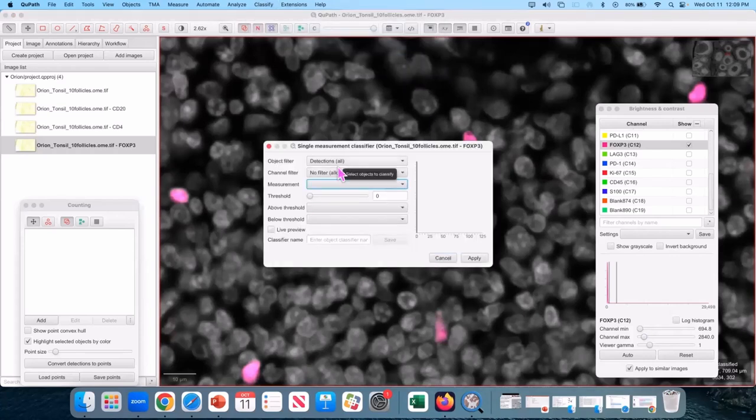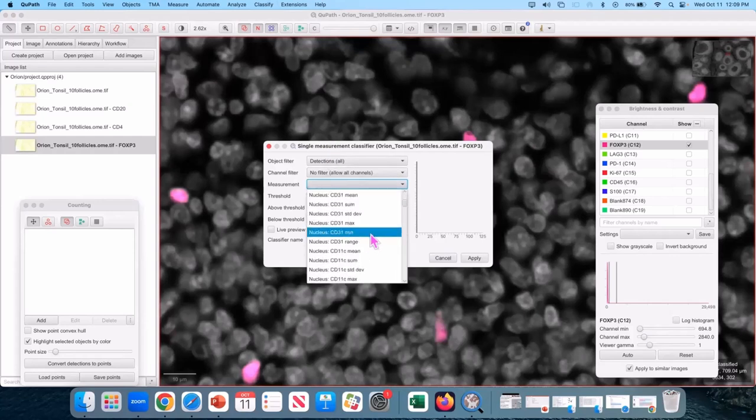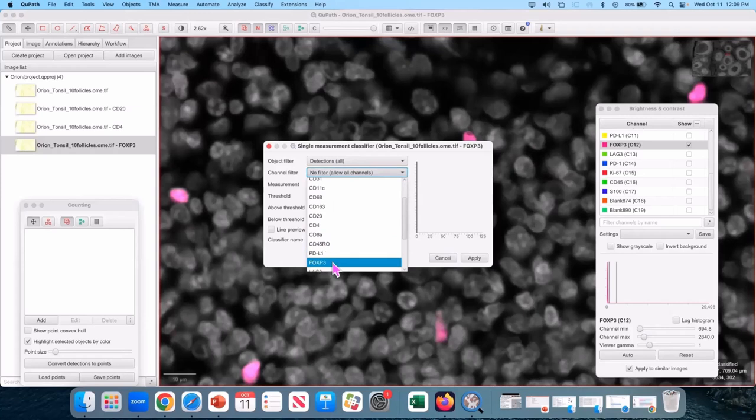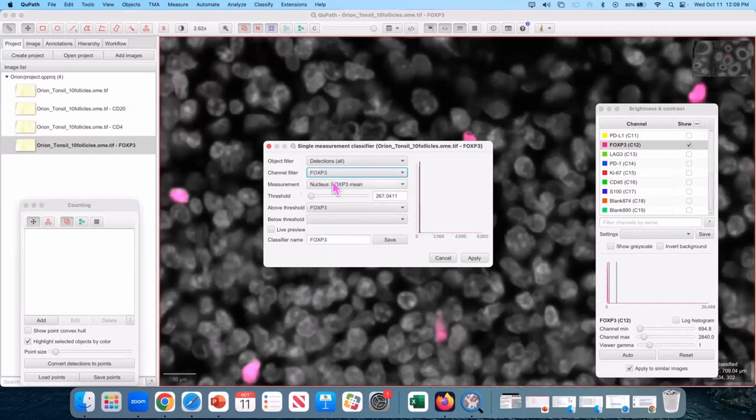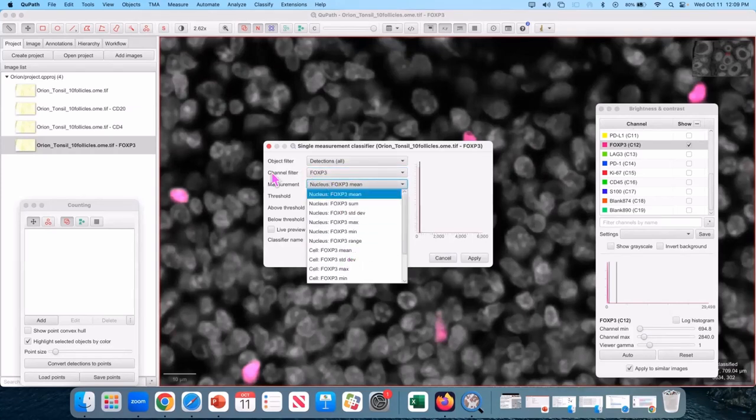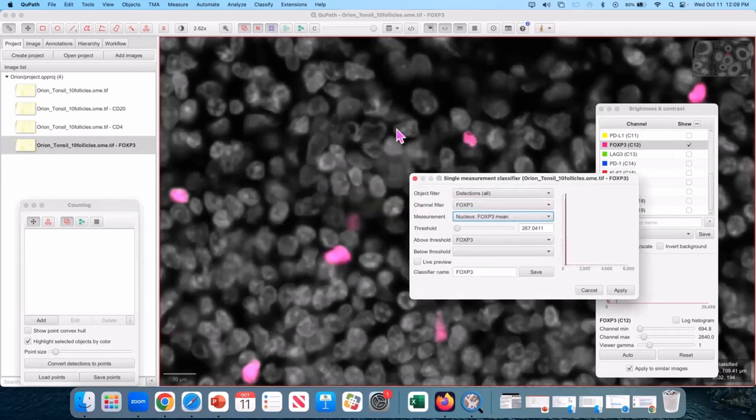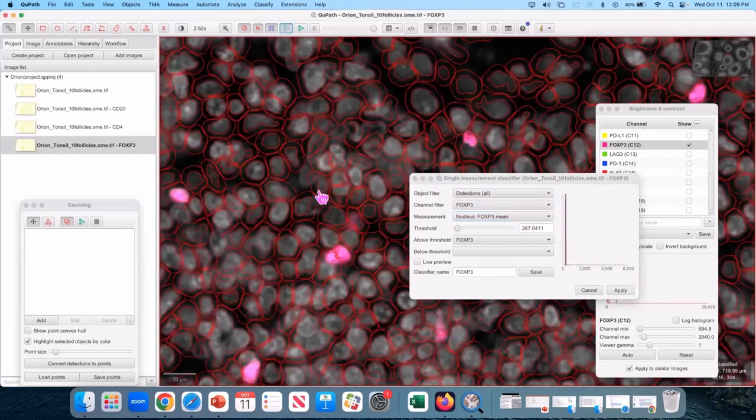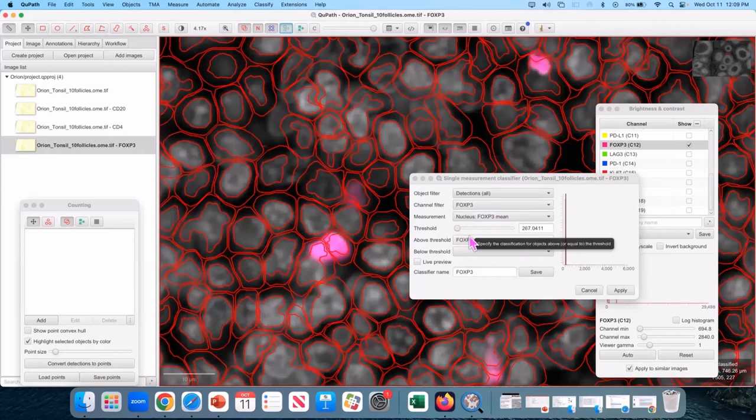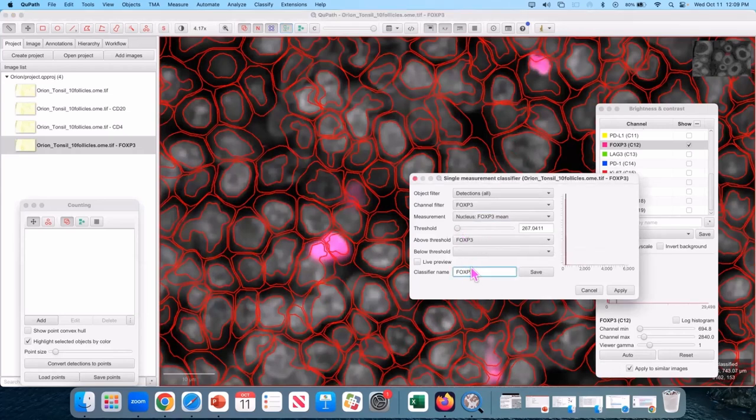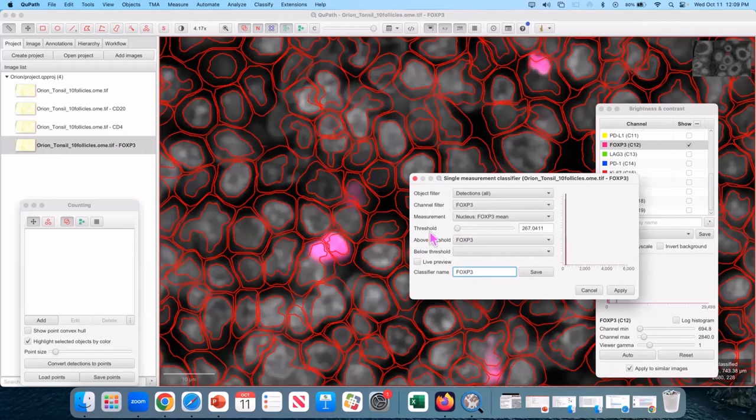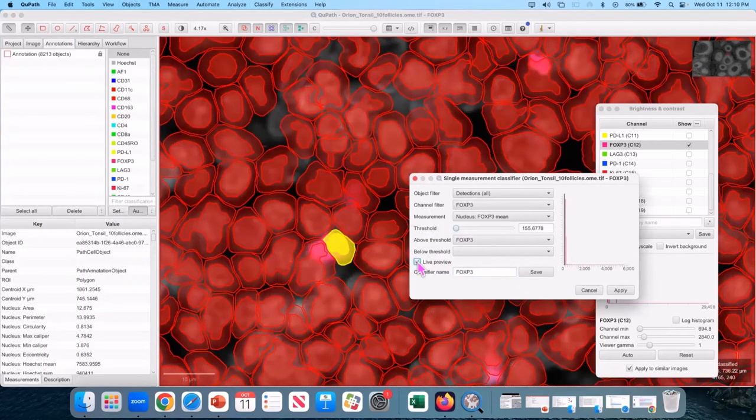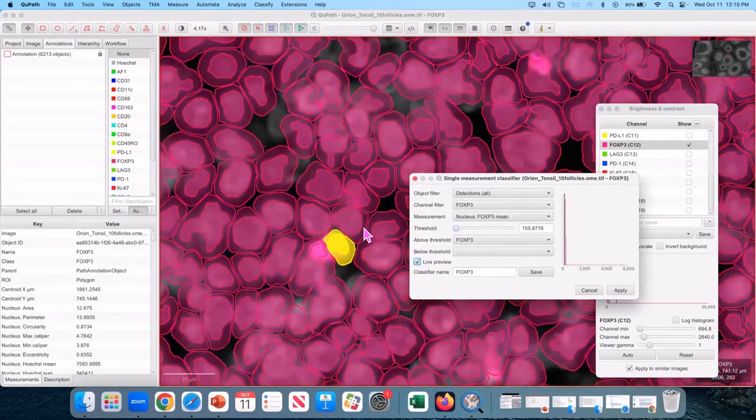Once you load up the single measurement screen, the measurement list is a lot. So you can go to your channel filter, pick FOXP3, and then it'll just limit this to what's relevant. Non-detections, and when you do that, it auto-sets that your above threshold should be FOXP3. And that your classifier name should be FOXP3. It tries to make this as easy as you can. You do have to hit live preview or nothing happens.